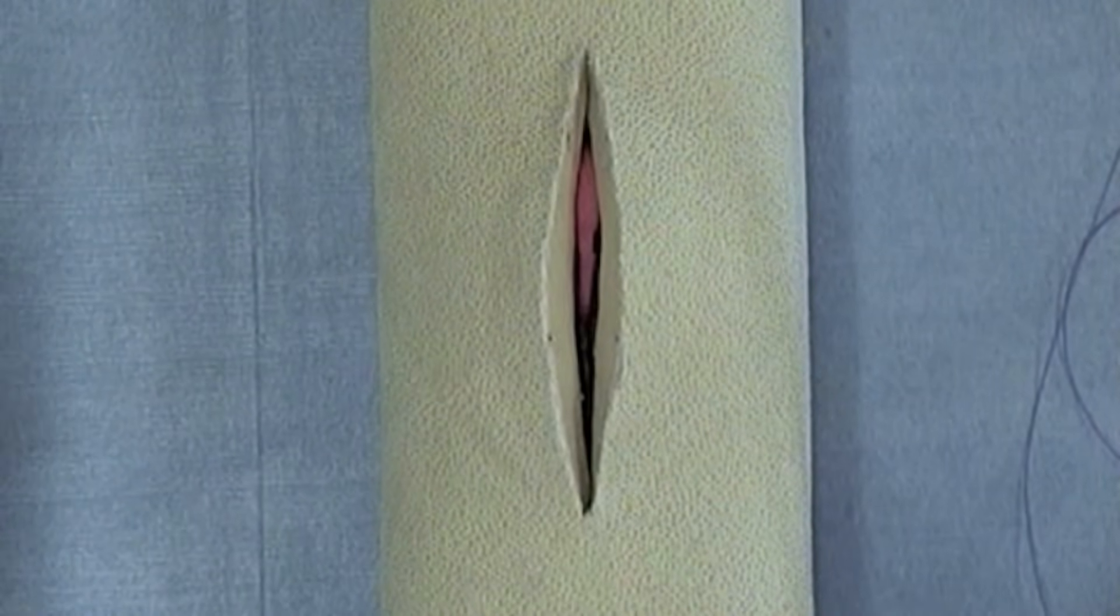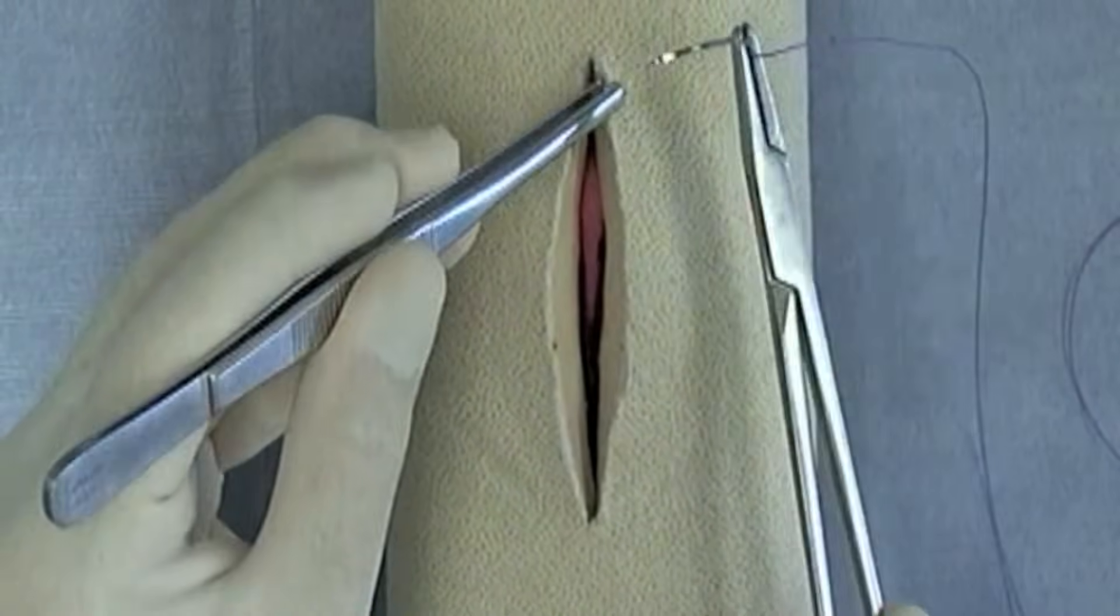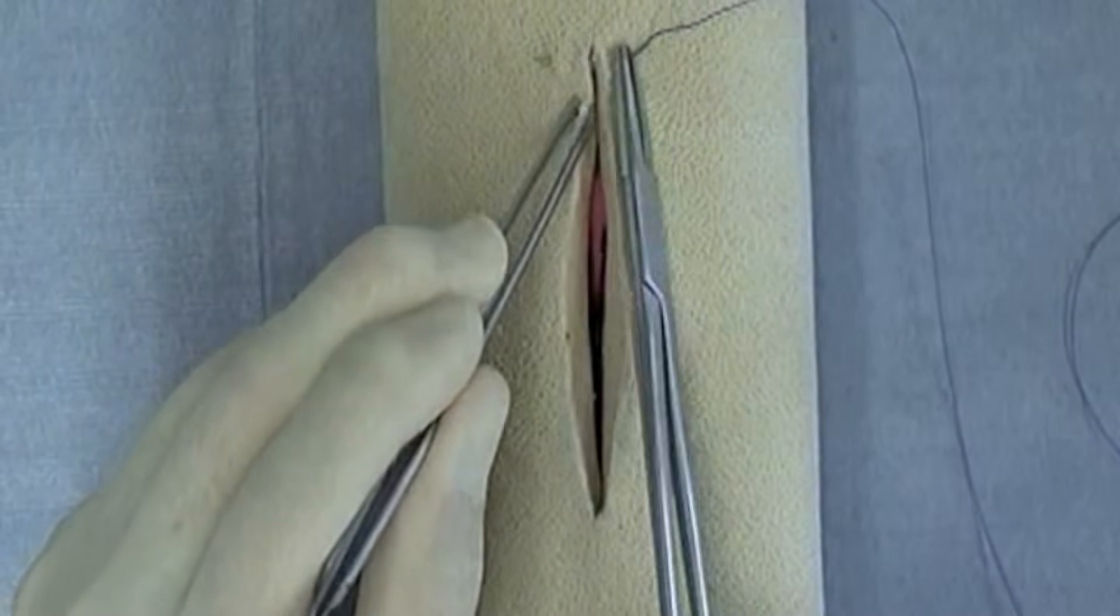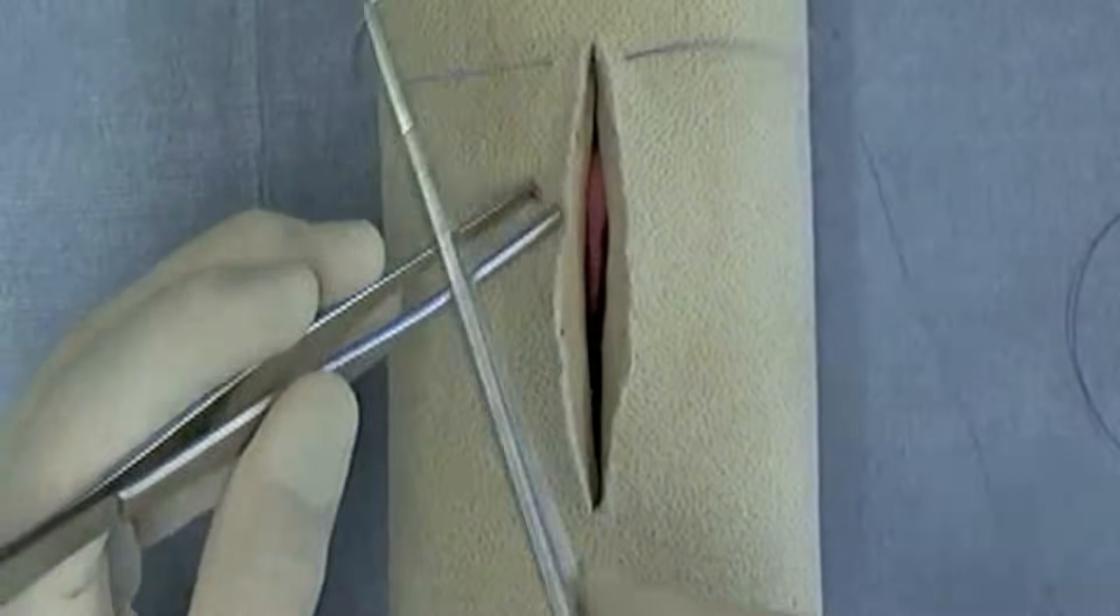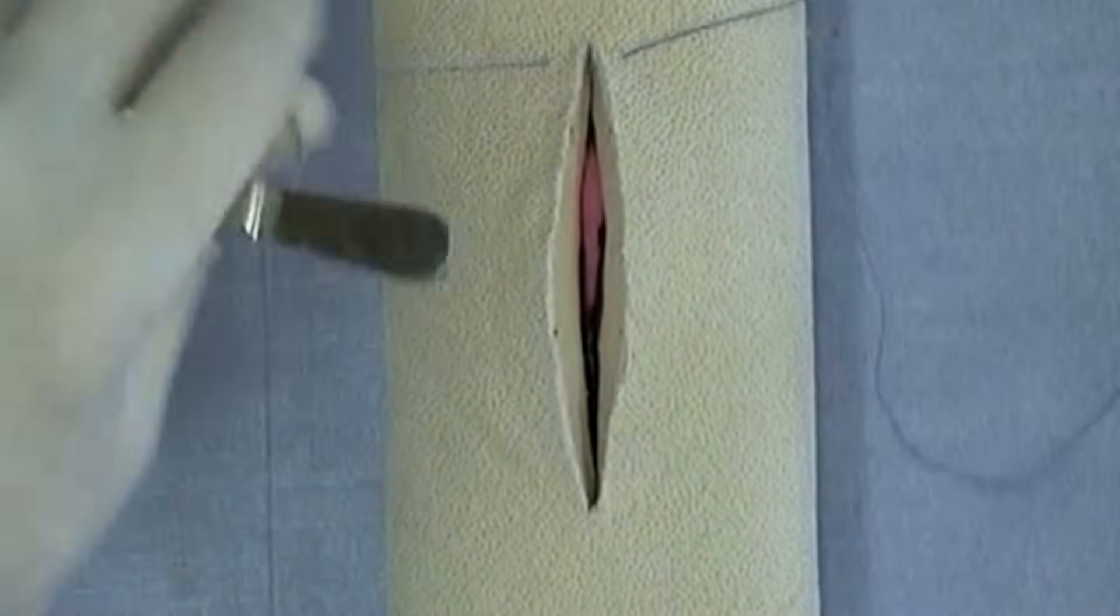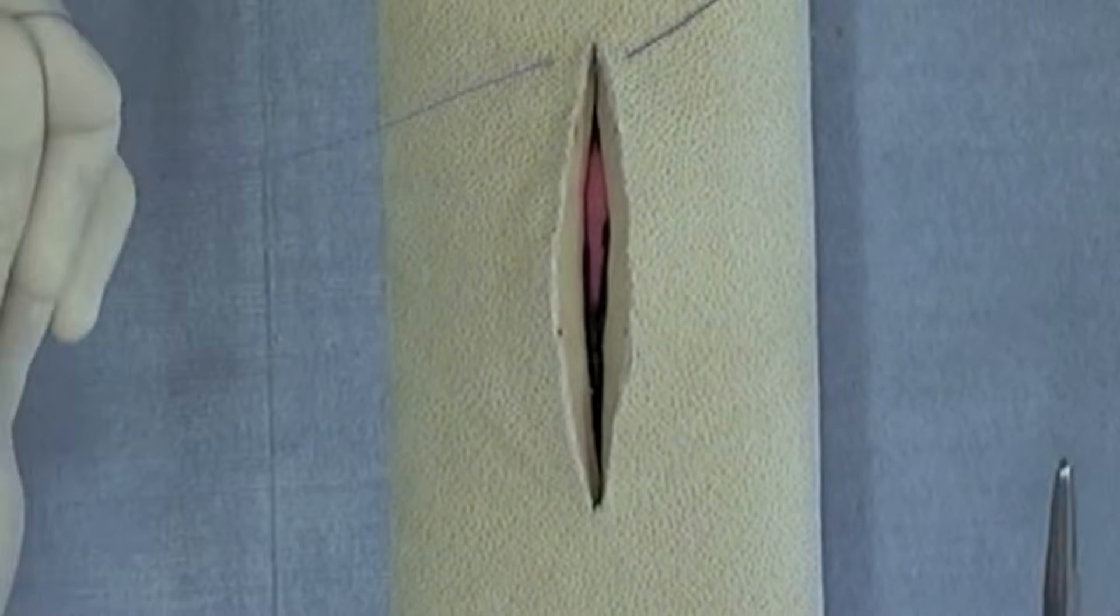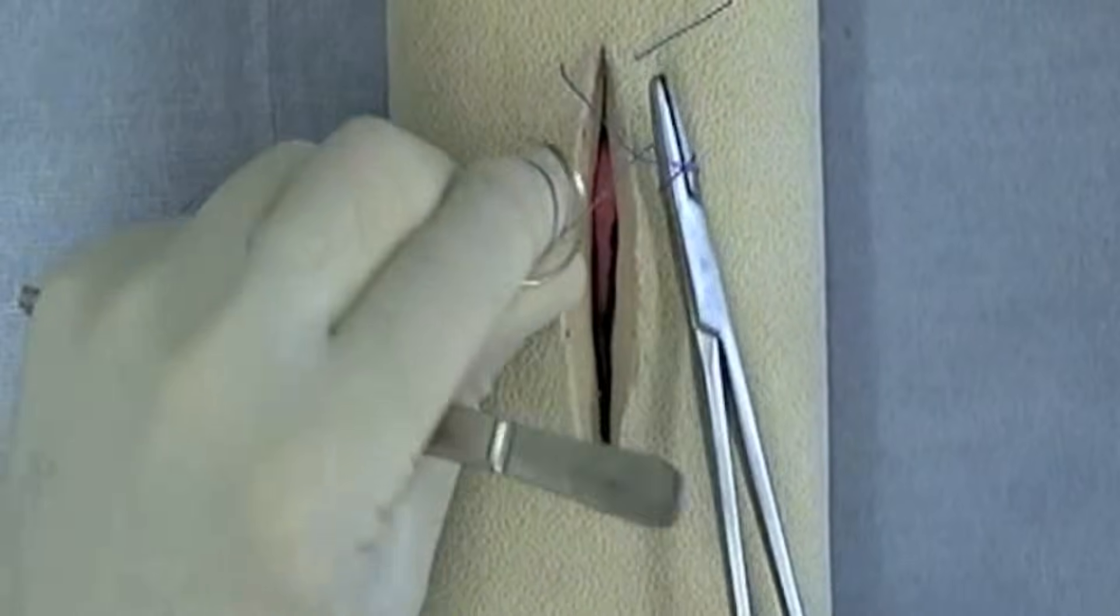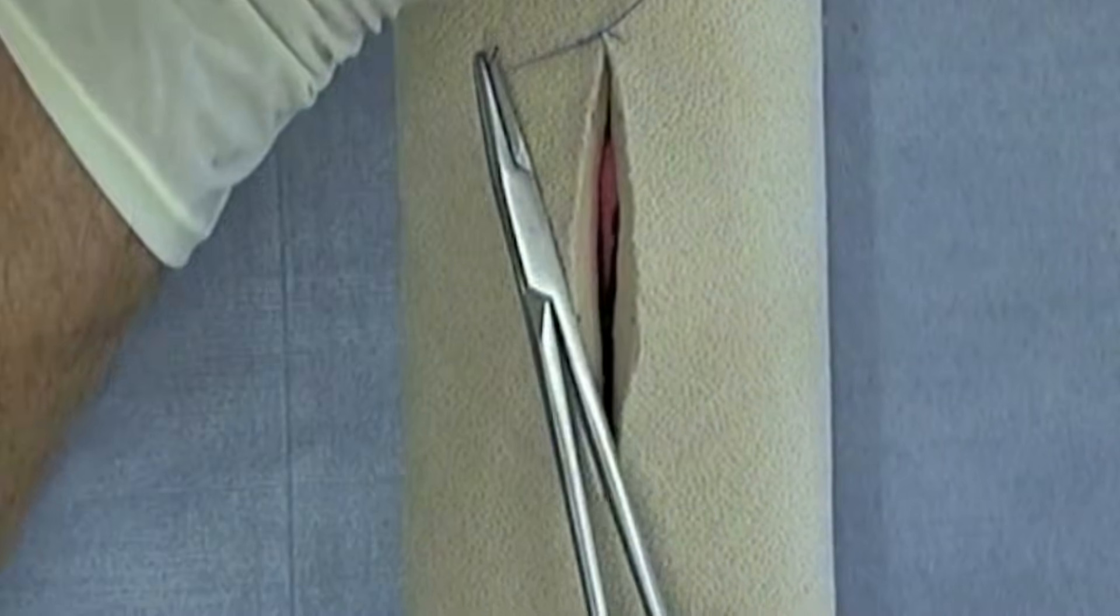It's continuous in nature and the way in this course that we teach to begin continuous suture patterns is to perform a simple interrupted suture bite and then tie. This is the way I would recommend beginning the suture patterns of many of the continuous sutures that we will be doing in this course.